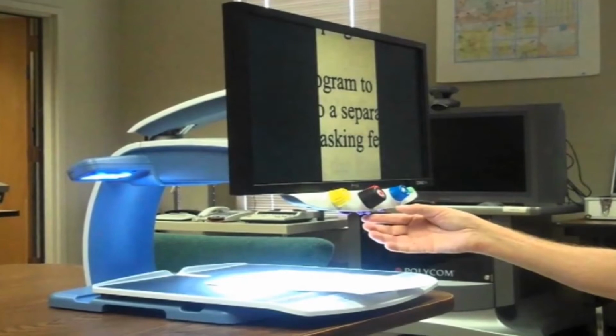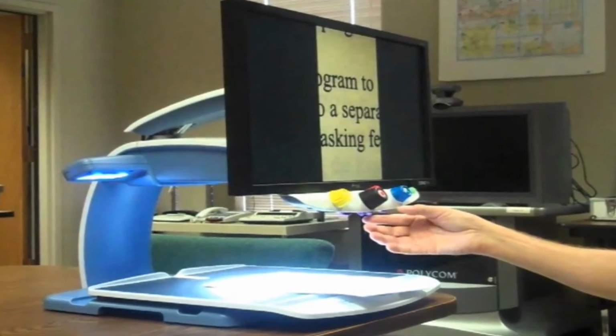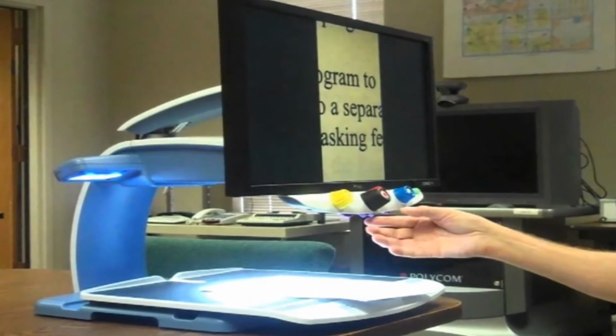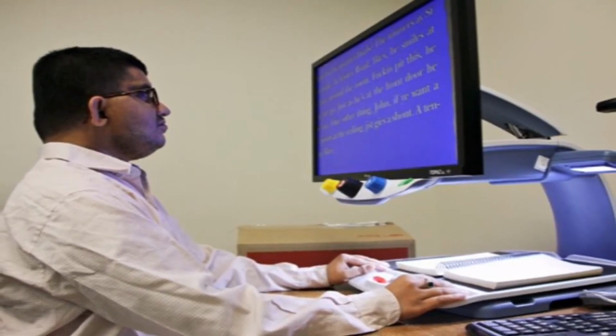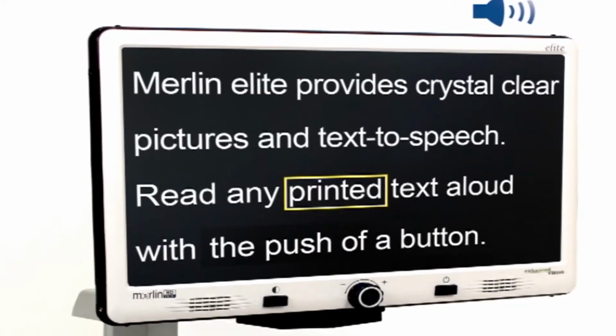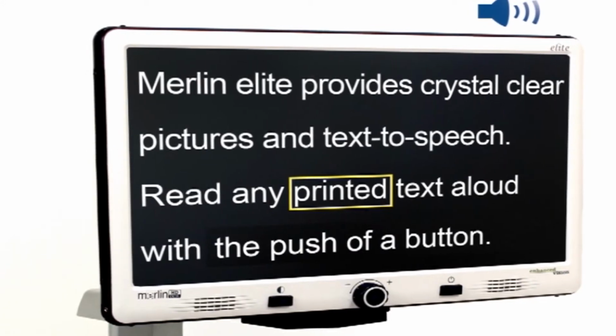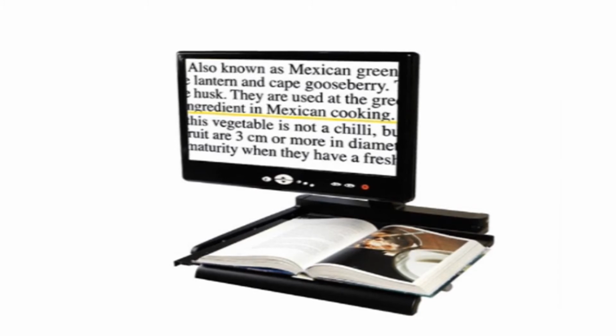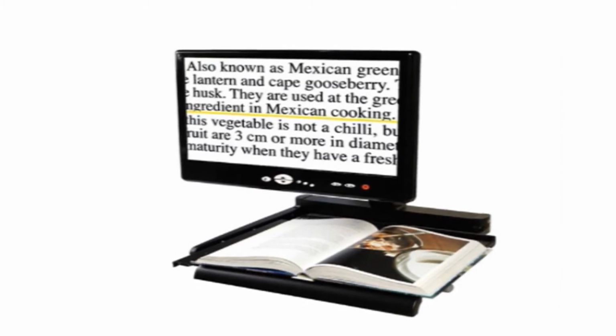Closed circuit television (CCTV). When these traditional optical low vision aids do not help to accomplish a task, electronic aids might help. Closed circuit television (CCTV) helps people who need greater magnification than reading glass and magnifier. It allows the person to adjust the size, brightness and contrast of the magnified image. The person can even read white letters on a black background to decrease the glare. CCTV is more expensive and far less portable than other near vision aids.